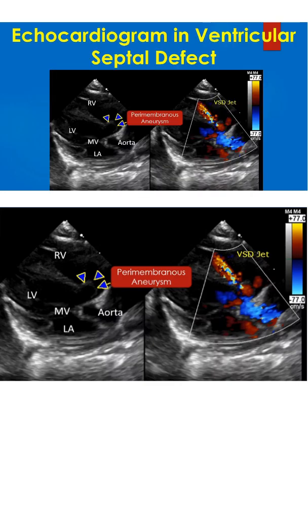The right panel shows the mosaic VSD jet from the apex of the aneurysm into the right ventricle. Other structures seen in the image are the aorta, left ventricle, and left atrium. The mitral valve is in the closed position, as it is a systolic frame.